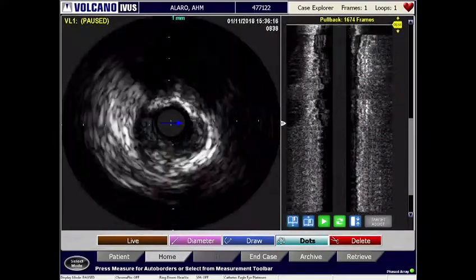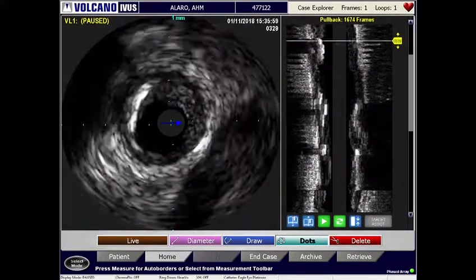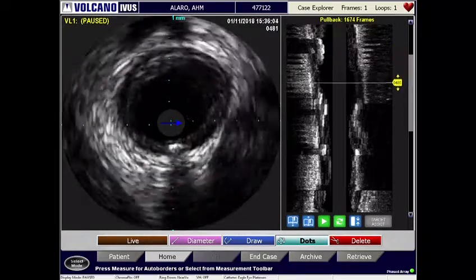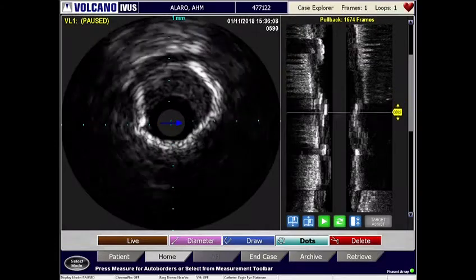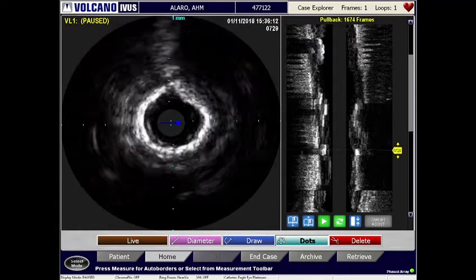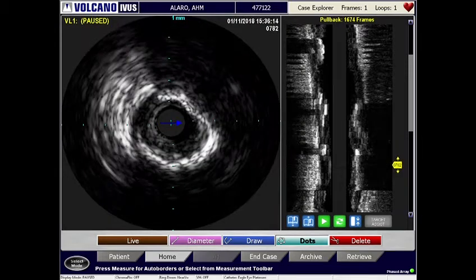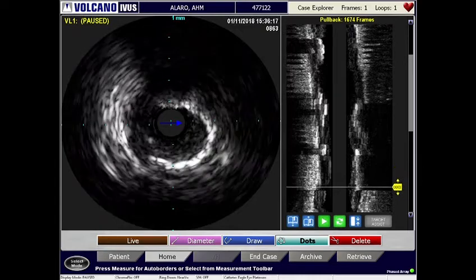We are all the way down in the circ at this level, and we see that there is a lot of disease. At this level, we are still in the small circ. Balloon. What kind of good balloon do we have? This is a 4 millimeter vessel, media with a lot of superficial calcification.